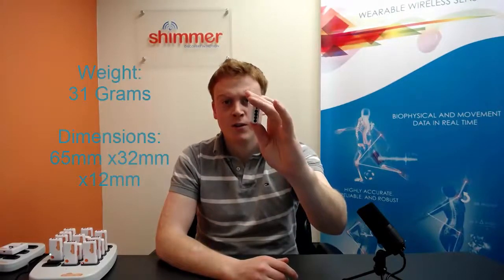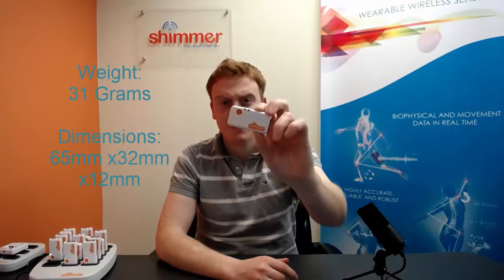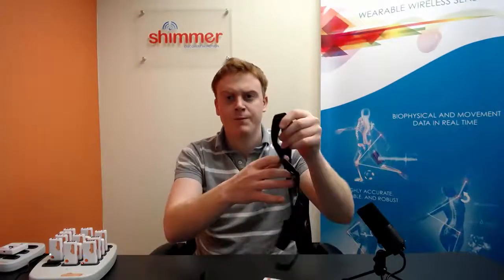Firstly, let's introduce the hardware required to collect data, beginning with the sensor. As you can see, the Shimmer3 EMG sensor is quite lightweight, weighing just 31 grams with dimensions of 65mm x 32 x 12. Each Shimmer sensor comes with a wrist strap and waist strap for placement on the body depending on your specific application.